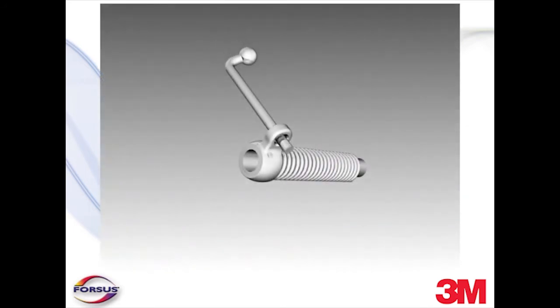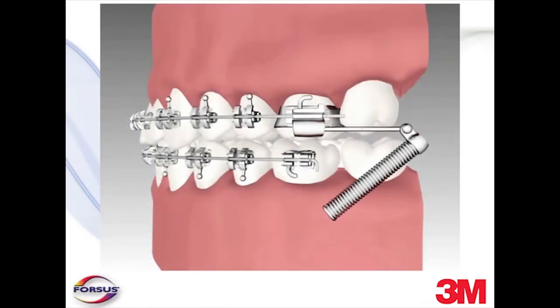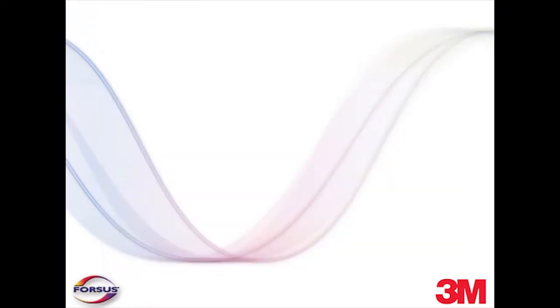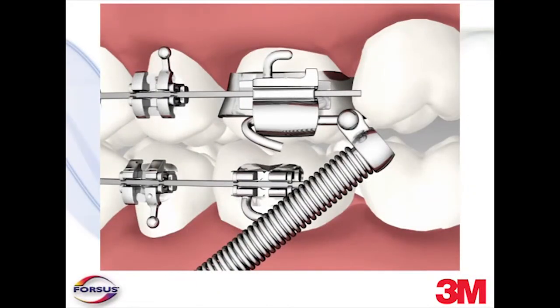To install the L-PIN module, thread the L-PIN through the eyelet in the universal spring. Then thread the L-PIN through the distal entry of the headgear tube. Allow about two millimeters of space between the distal end of the buccal tube and the universal spring eyelet. Crimp the L-PIN around the headgear tube and trim as necessary with a pin and ligature cutter.